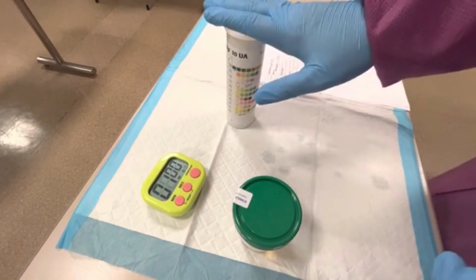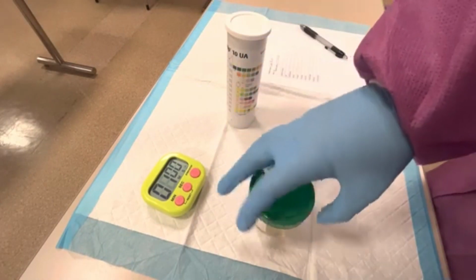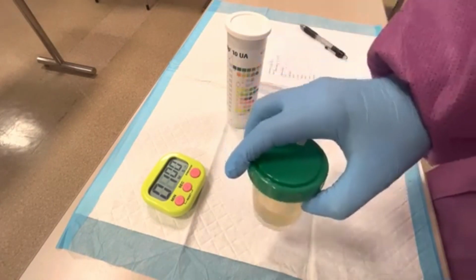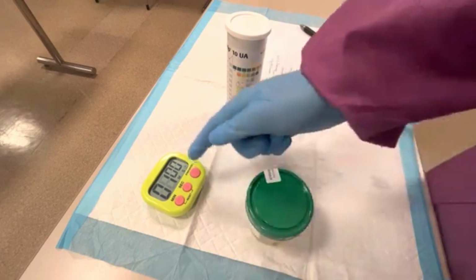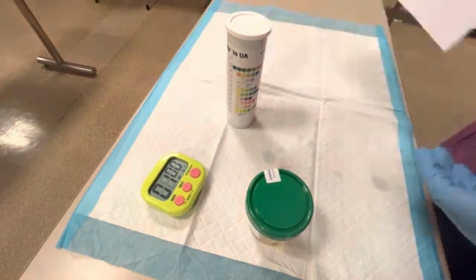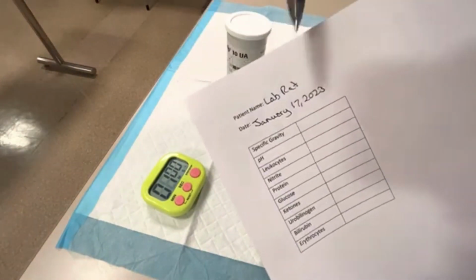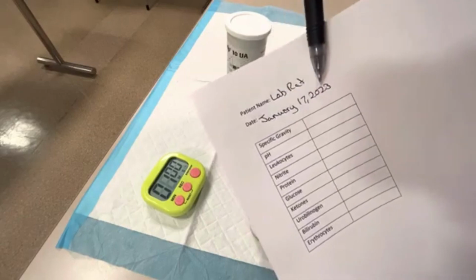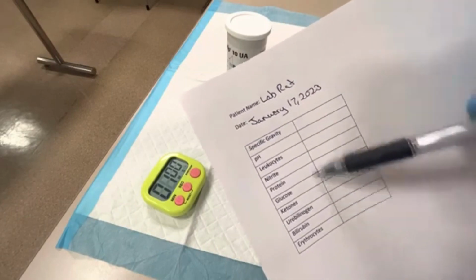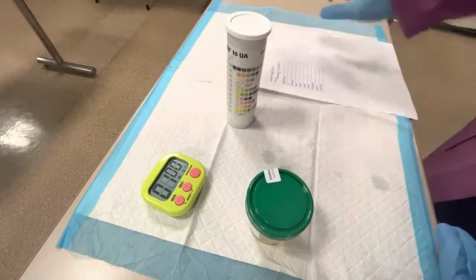So again, I have this reagent pad. I've got my fresh urine, and this is at room temperature, so it has not been refrigerated. I've got my timer set for a minute, which is 60 seconds, and then I have my resulting sheet. I'm going to call this patient Lab Rat. How convenient. Today is January 17th, 2023. And then here are all my result windows, and I'm going to be labeling this patient's results on this form.